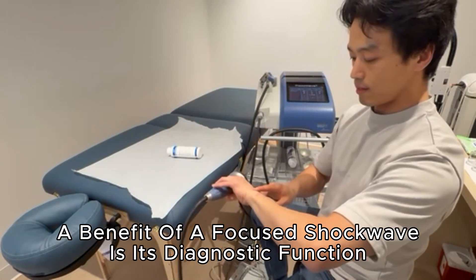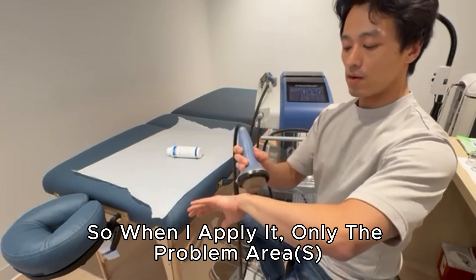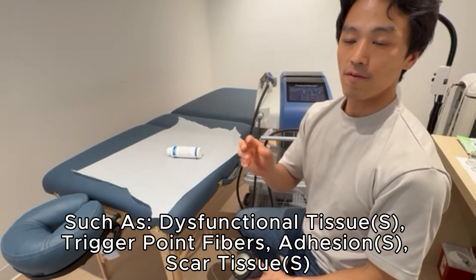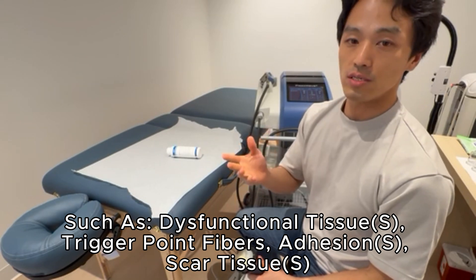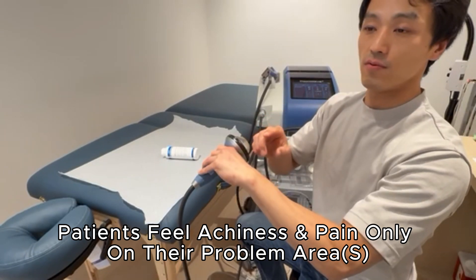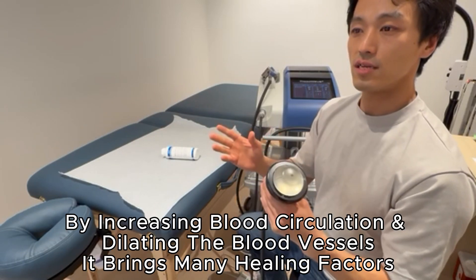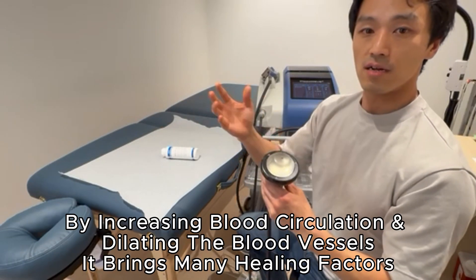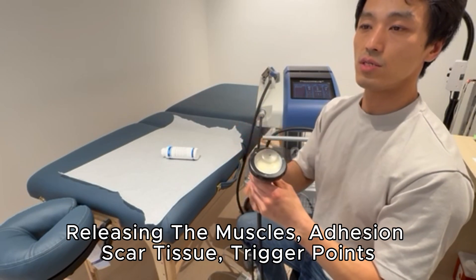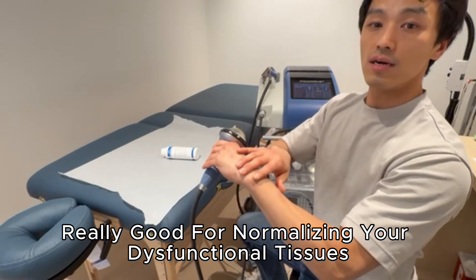A key benefit of focused shockwave is that it has a diagnostic function. When I apply it, only the problem area — dysfunctional tissue, trigger points, fibrosis, calcification, adhesion, scar tissue — will feel achiness and pain. The machine literally releases and normalizes that tissue, increases blood circulation, dilates blood vessels, and brings healing factors such as stem cells to release the muscle, adhesion, scar tissue, and trigger points.